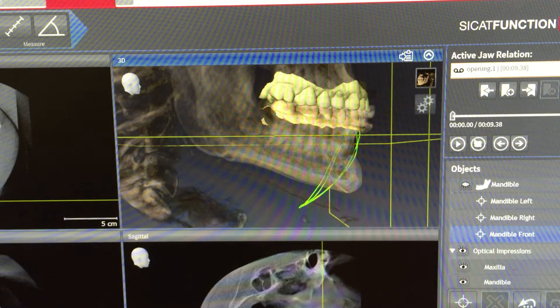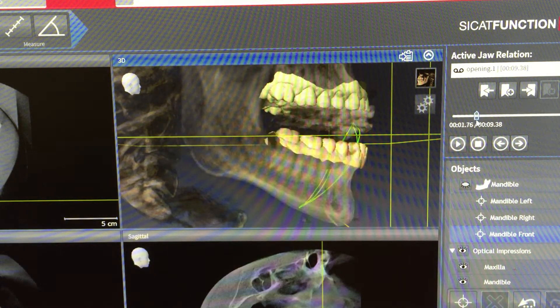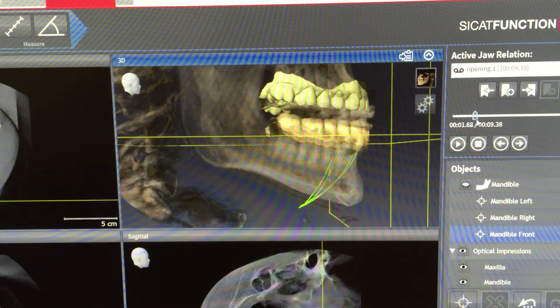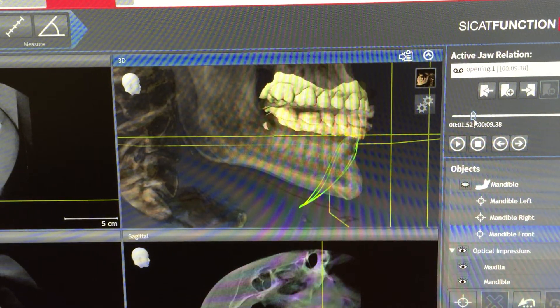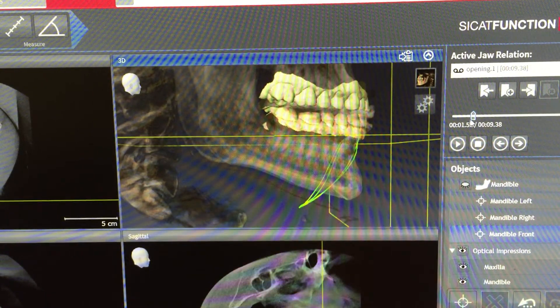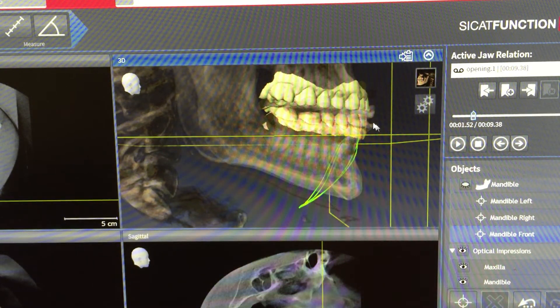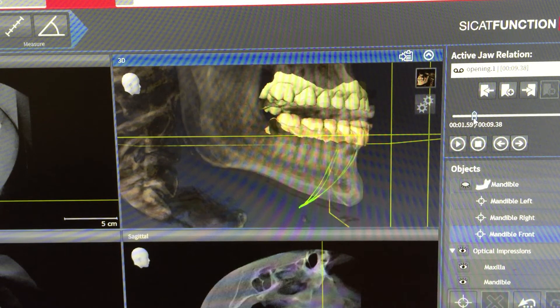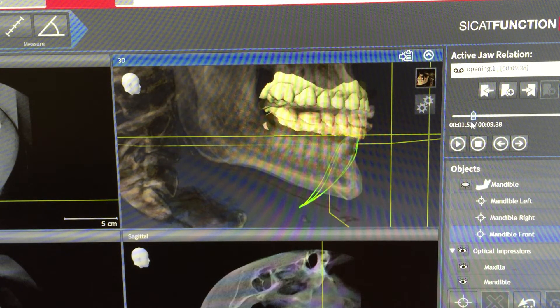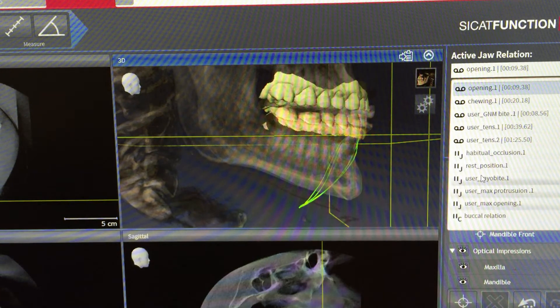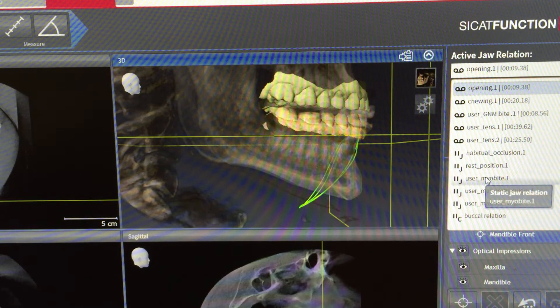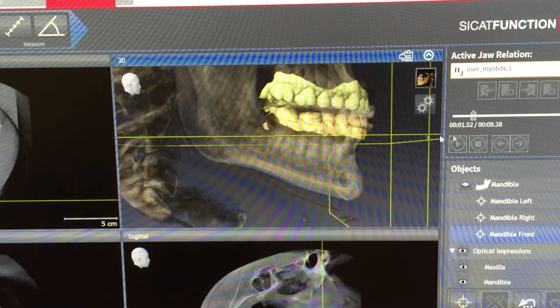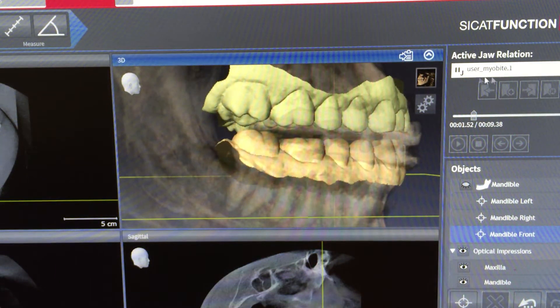The point is we can determine the mandibular position just by identifying on screen where the kinematics of the tracing — the kinematics of the mandibular movement — is most ideal. In this graphic right here, I stopped the cursor right before the compression and distalization of the mandible, and I can see that with my myobite — my optimized bite — I arrive at pretty much the same spot.